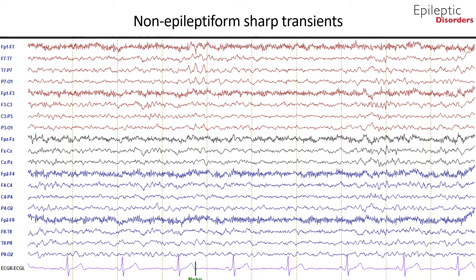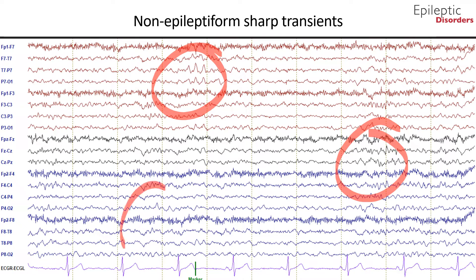In this bipolar montage, we will look at non-epileptiform sharp transients, also known as spiky fluctuation of the background activity. You can see sharply contoured waveforms consistent throughout the recording, as outlined in red in the temporal and parietal regions, as well as the midline channels and the right parietal regions.